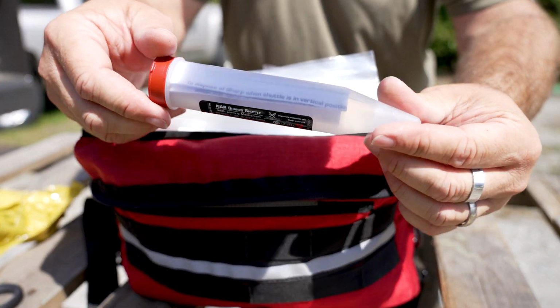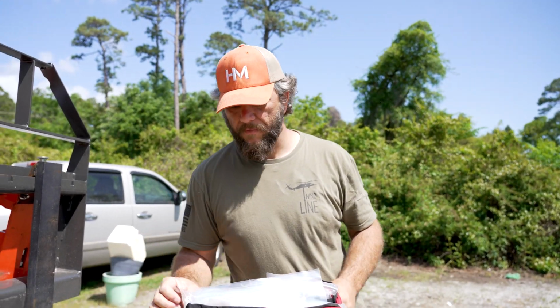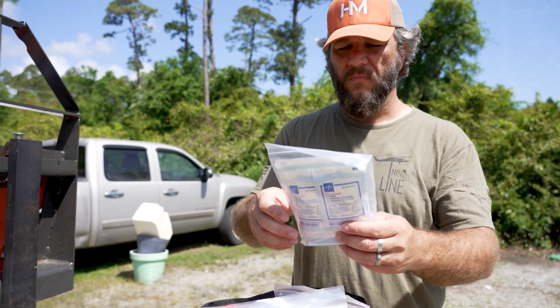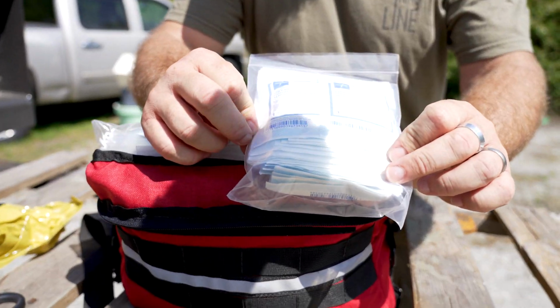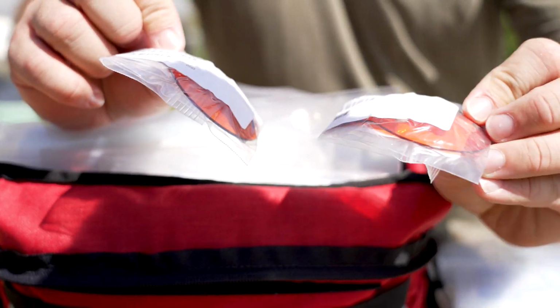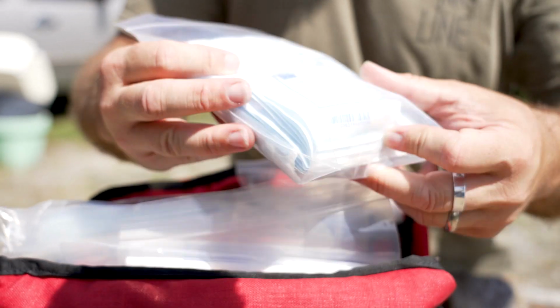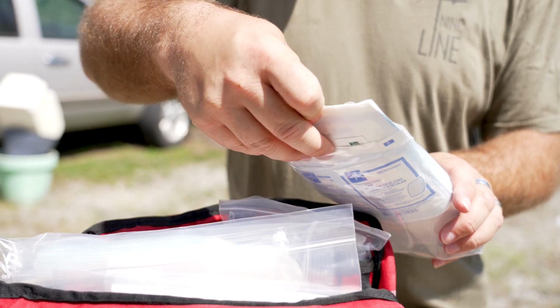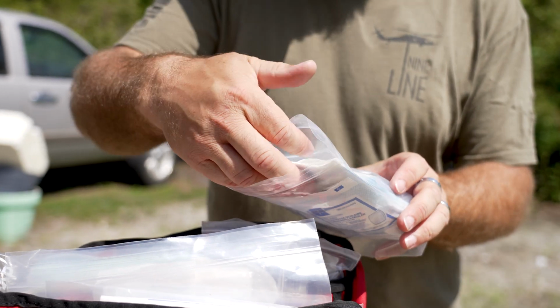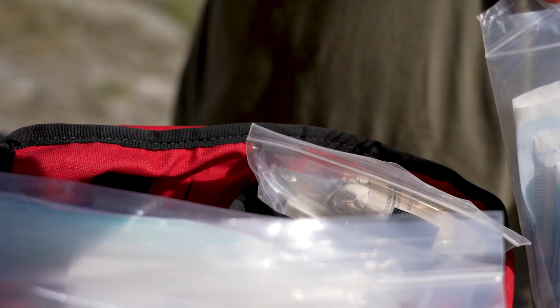Sharps shuttle, okay, that's for putting needles, stuff like that, anything you don't want to contaminate yourself with, you want to put it in there. There's one of the packs that comes in it. This is eye pads. You can see here, eye protectors, gauze. Let's see, what do we got here? 4x4, 3x3, and 2x2 gauze sponges for eye wounds.